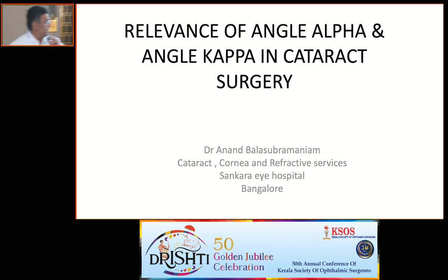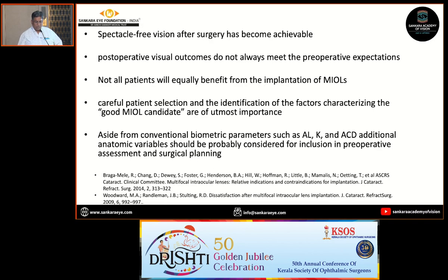Good morning. Thank you, Dr. Saji, for including me in this symposium. The topic for me is the relevance of angle alpha and angle kappa in cataract surgery. As we all know, spectacle-free vision after surgery has become achievable, and that is because of careful patient selection and the identification of factors which characterize a good multifocal candidate. Aside from the conventional biometric parameters like axial length, keratometry, and anterior chamber depth, additional anatomical variables should be considered as an inclusion criteria for preoperative assessment and surgical planning.